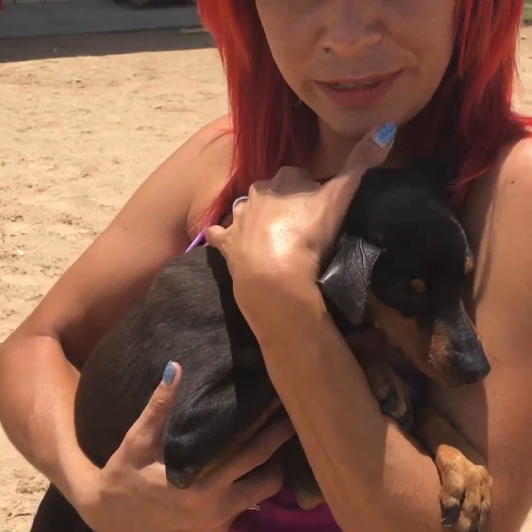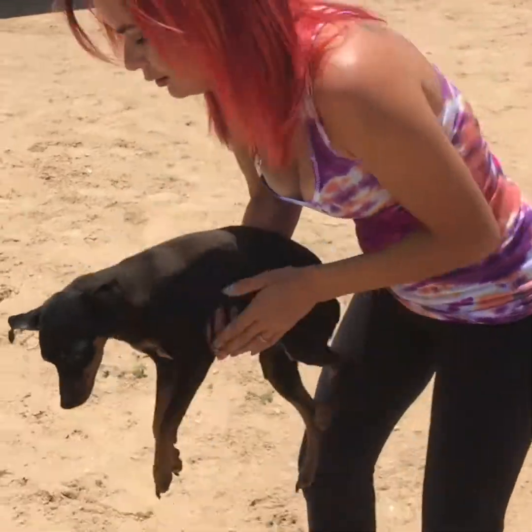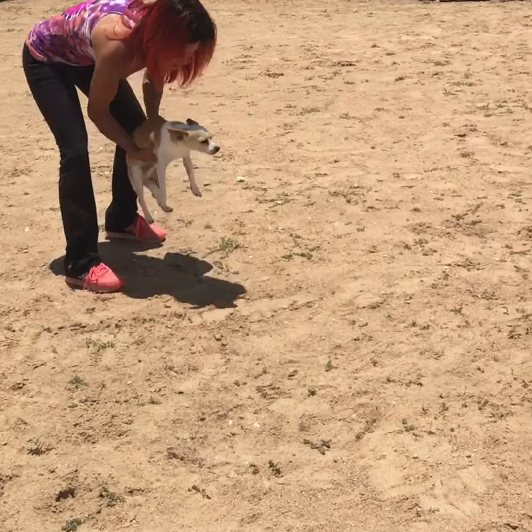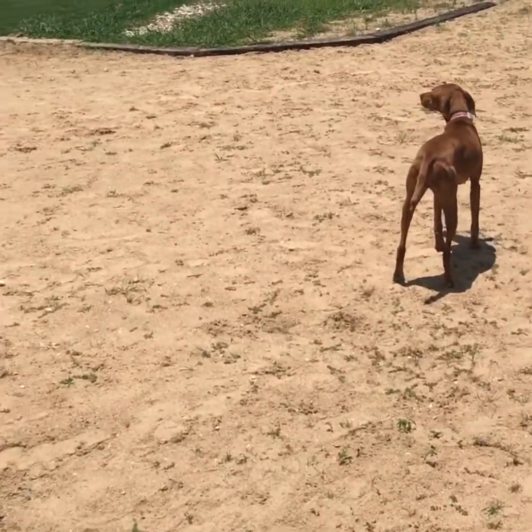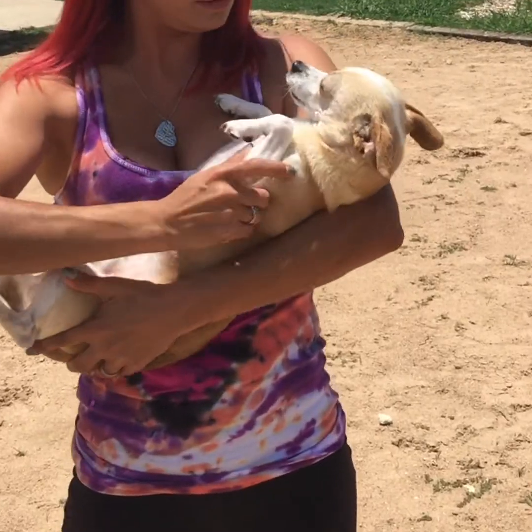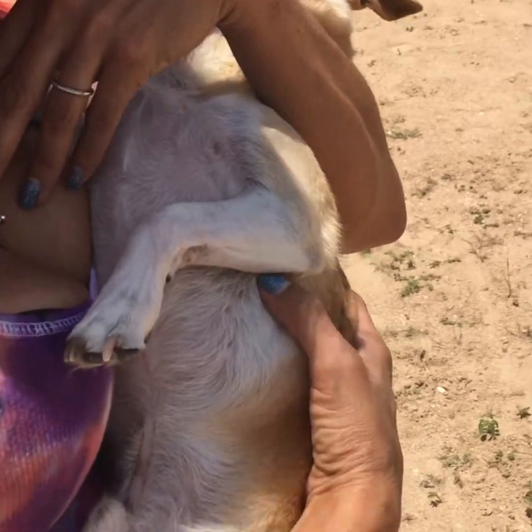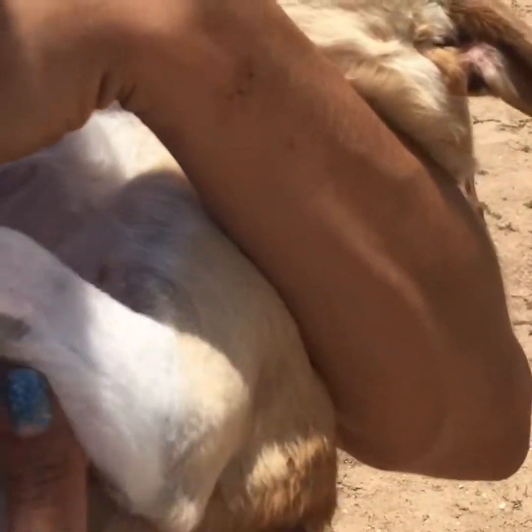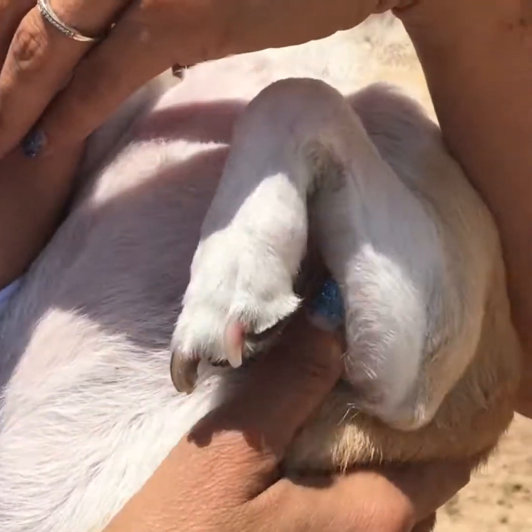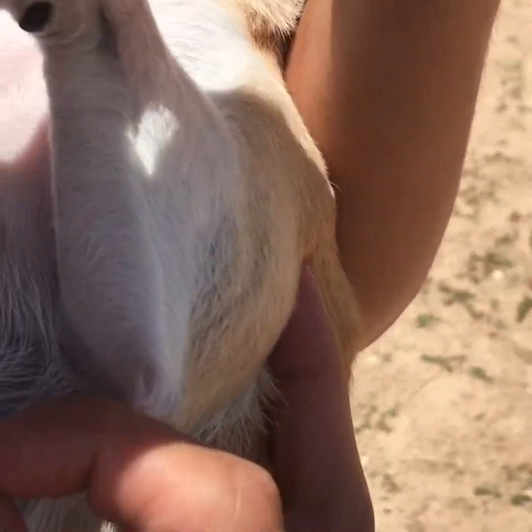For an easy small dog, all you have to do is lay him like a baby, give him a nice hug, talk to him, and he doesn't even notice when somebody comes for his pad. You can do his pad with your right hand while holding him in your lap and just poke him — easy peasy.